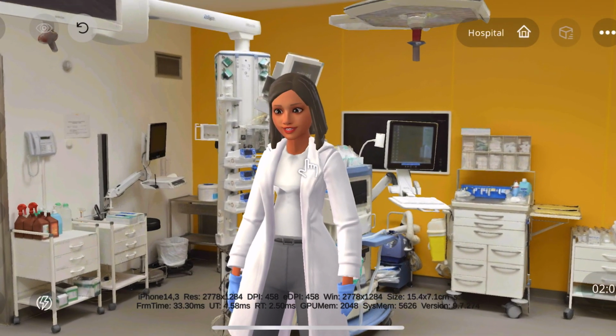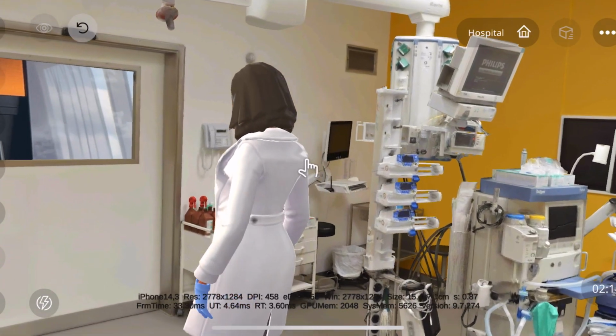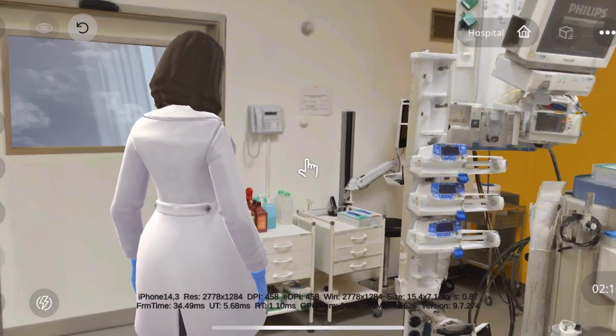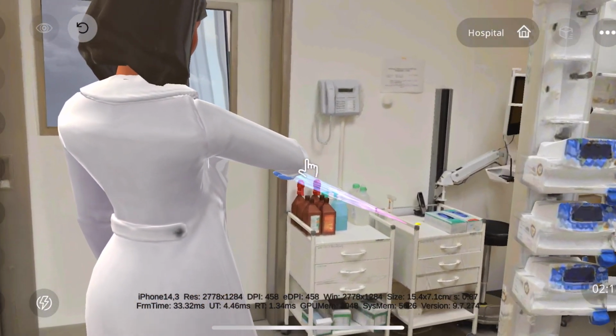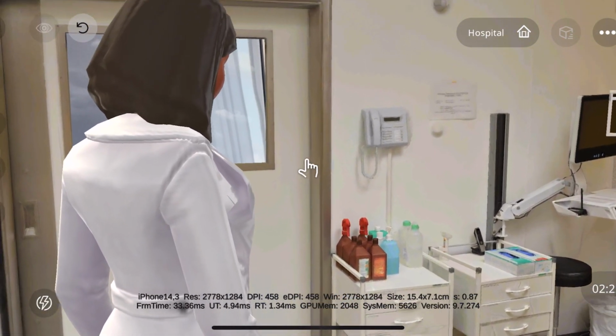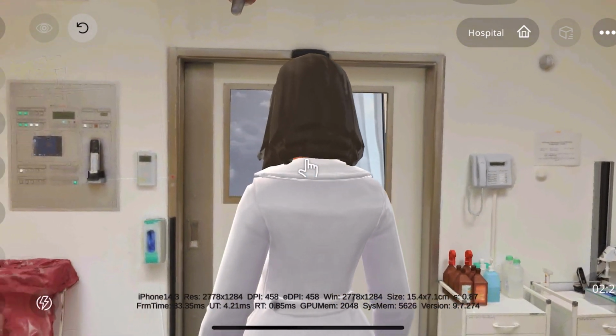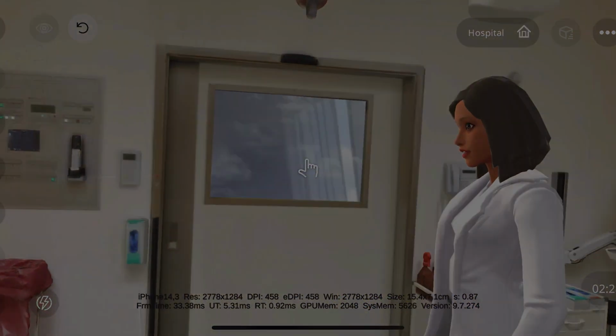How about surgical instruments? Do you see any? Surgical instruments. These are located on a table next to the patient on the left side of the room. They are tools that are used by the surgeon to perform the surgery. They include scalpels, scissors, forceps, clamps, retractors, sutures, needles, and cautery devices.